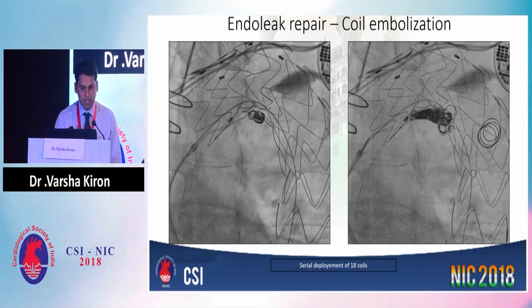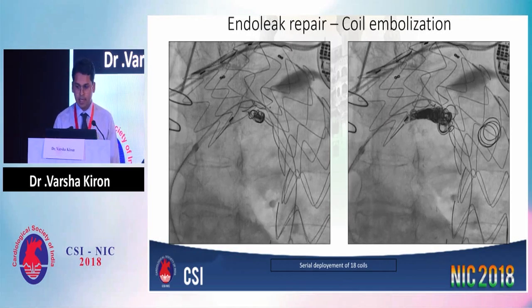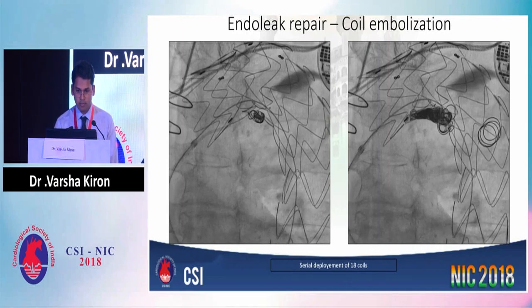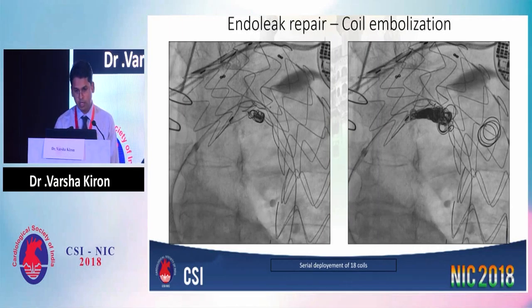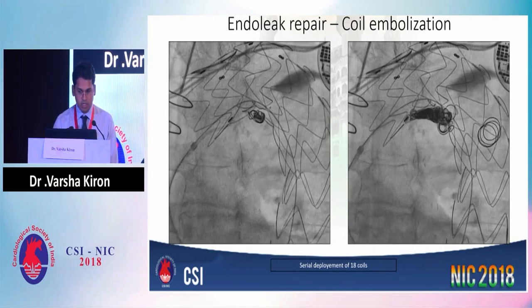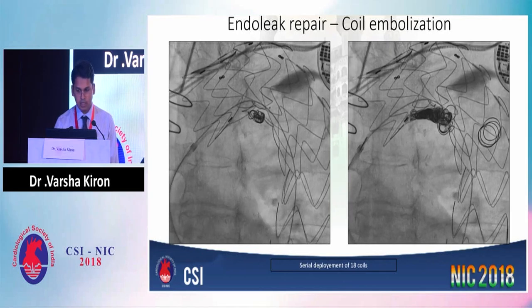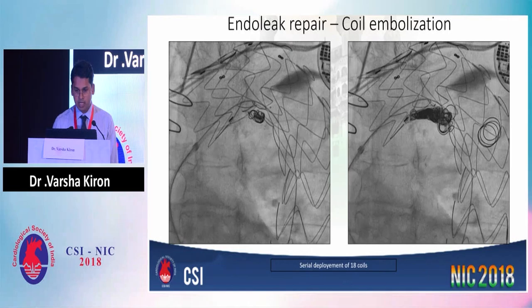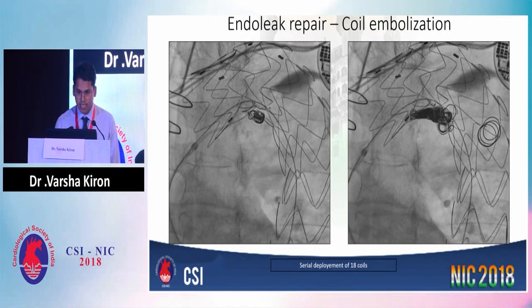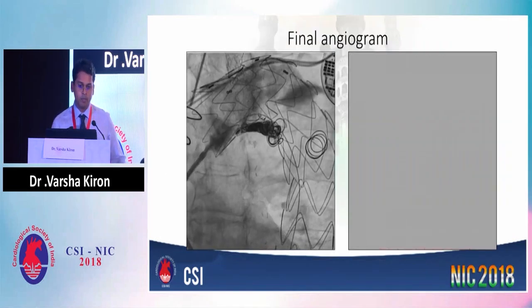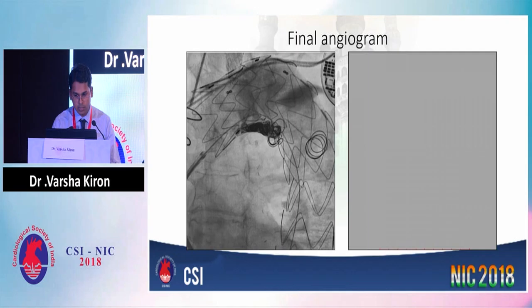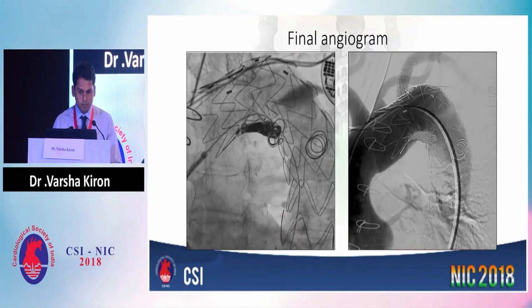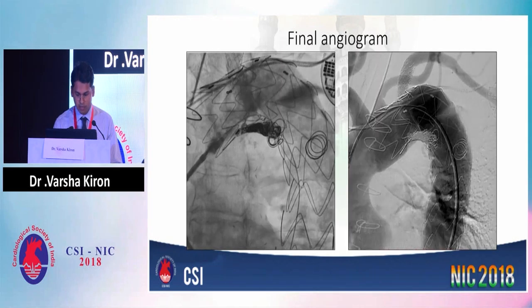This is the serial deployment of coils. Initially we deploy larger coils as they fill up the space, and later on we put smaller and smaller coils so it forms a compact mass. We had actually deployed a total of 18 coils to completely pack down the mass and plug down the track to cut the endoleak. This is the final angiogram at the end of procedure, which shows complete cessation of the type 1 endoleak.